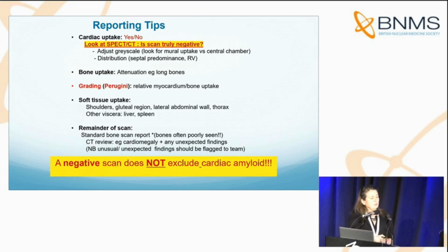And this is probably one of the most important statements of Carol and I's presentation, and that is a negative scan does not exclude cardiac amyloid. And you cannot use the DPD scan to diagnose the type of amyloid. That's our other main message. Okay, so back to Carol.